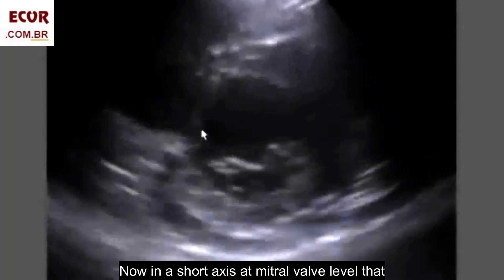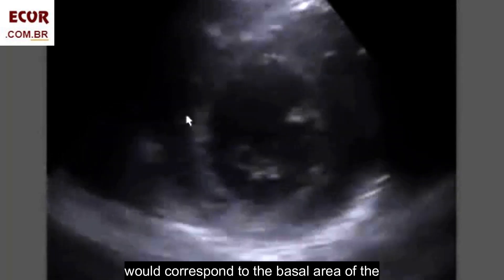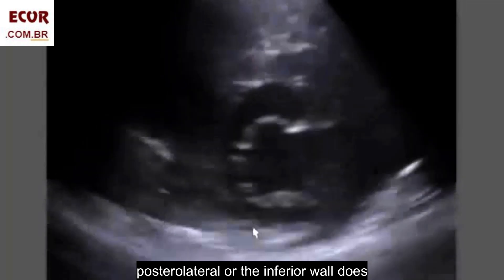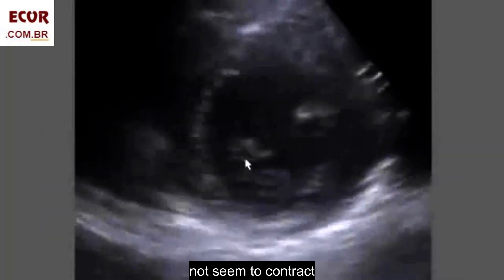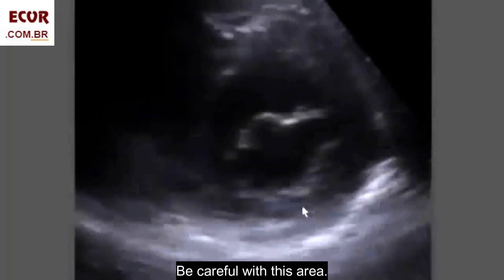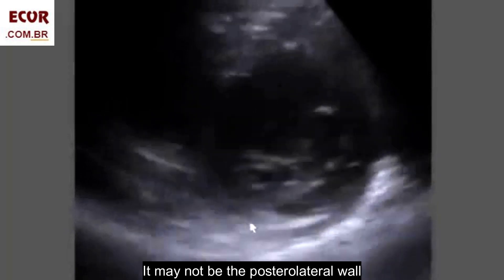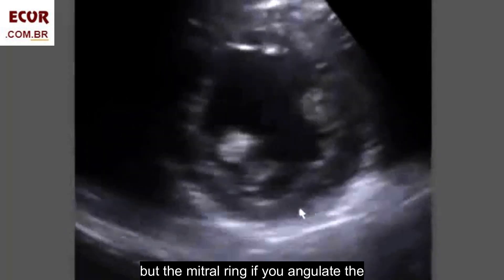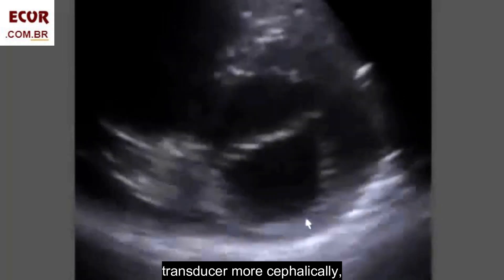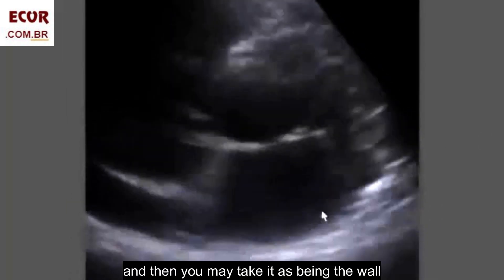Now, in a short axis at mitral valve level, that would correspond to the basal area of the posterior lateral or the inferior wall — it does not seem to contract well at first analysis. Be careful with this area: it may not be the posterior lateral wall, but the mitral ring, if you angulate the transducer more cephalically. And then you may take it as being the wall.